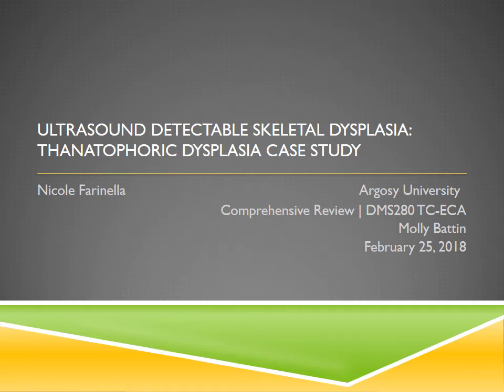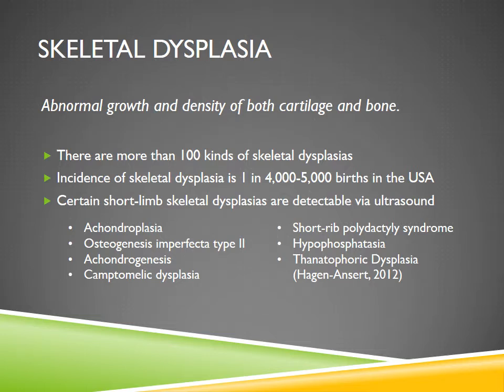Ultrasound detectable skeletal dysplasia, thanatophoric dysplasia case study. Skeletal dysplasia is an overarching term used to encompass abnormal growth and density of both cartilage and bone.